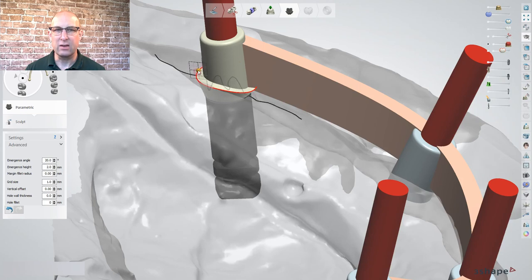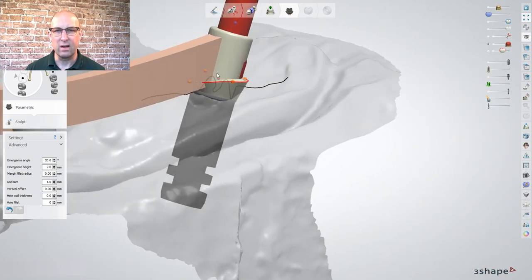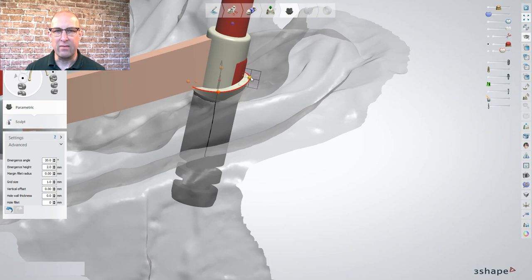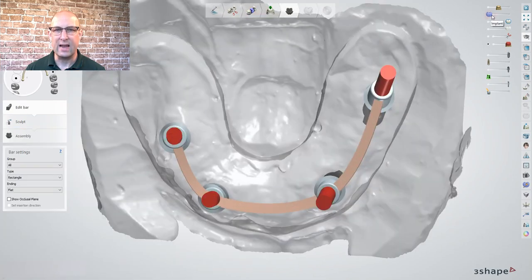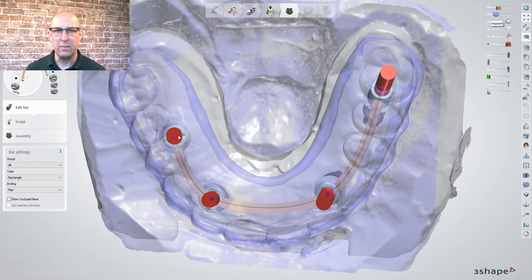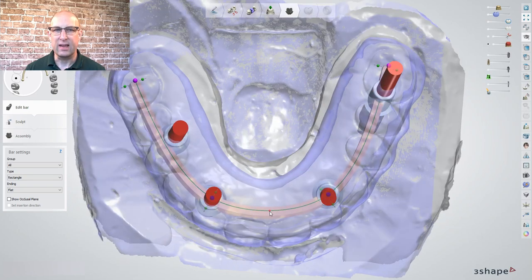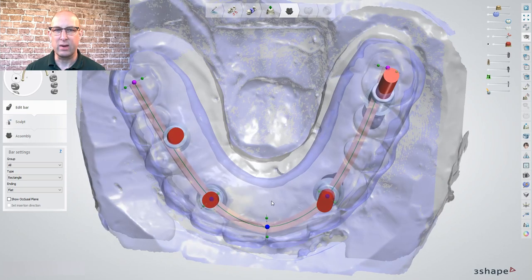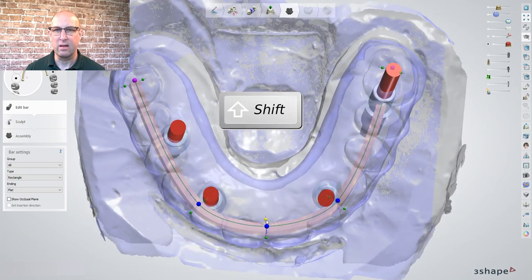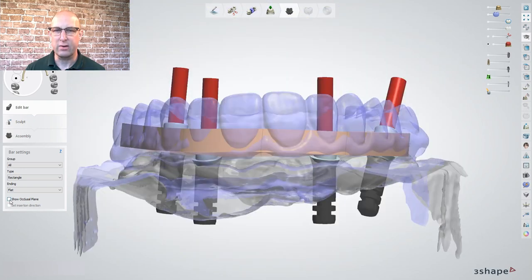Do not forget to activate the minimum thickness map and make sure no red is showing through the post walls. I'm adjusting the shoulder margins to an equal gingival level. The occlusal I extend 1mm above the minimum thickness. Make the pre-preparation scan 40% visible and extend both distal ends of the bar 2mm away from the distal wall of the last tooth. You can add green dots by clicking on the green line to shape the bar according to the teeth arch — I'm trying to keep the green line in the center of the teeth.